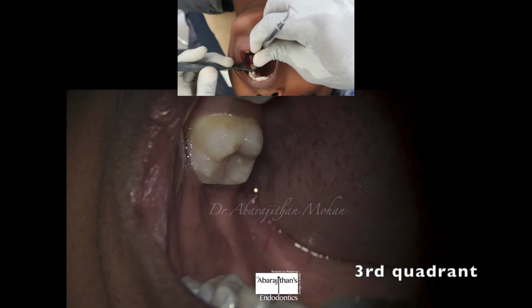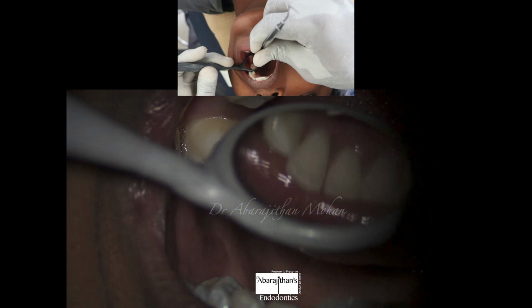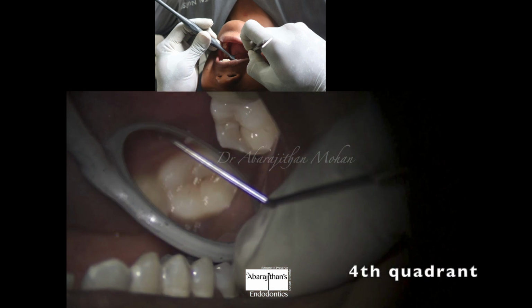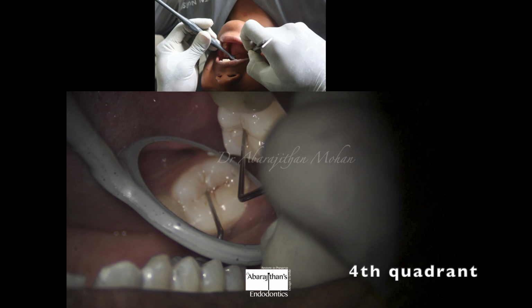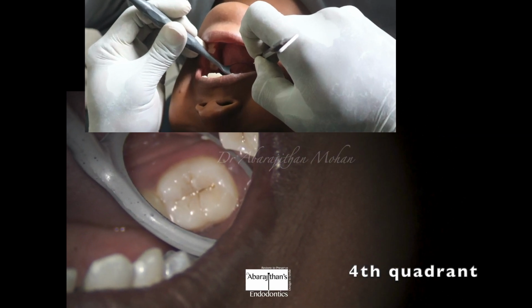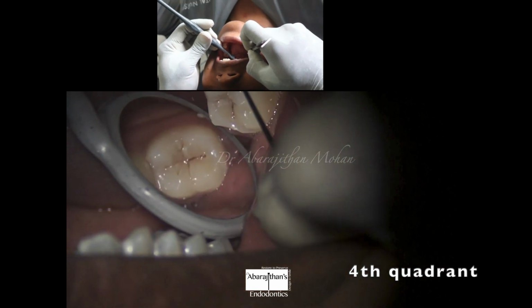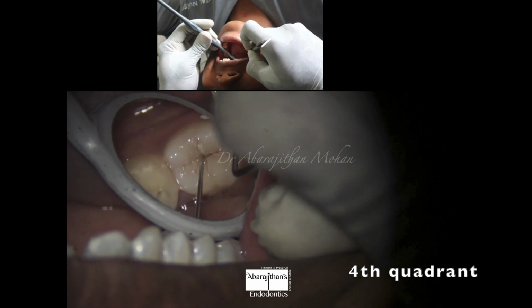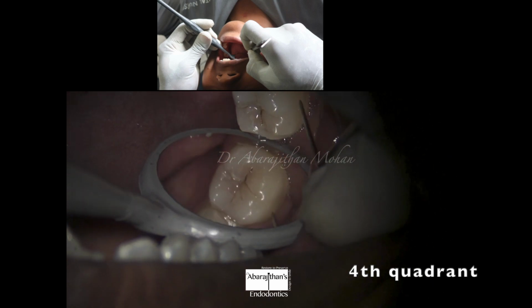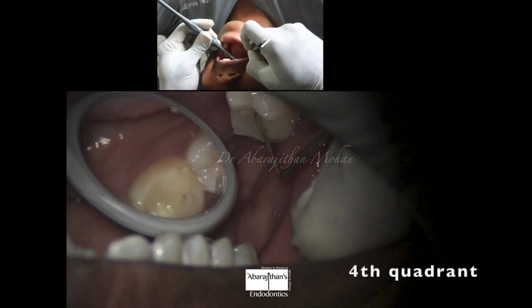So all procedures on mandibular teeth are also performed through indirect vision. So this is the fourth quadrant now. We are examining the last molar, which is the second molar here. Again, you can see the mouth mirror is placed distal to the tooth, and the mouth mirror can be gently moved from the distobuccal to the distolingual. But the most comfortable position for working is the distolingual cusp. The mouth mirror is just placed distal to the distolingual cusp during the endodontic procedures.